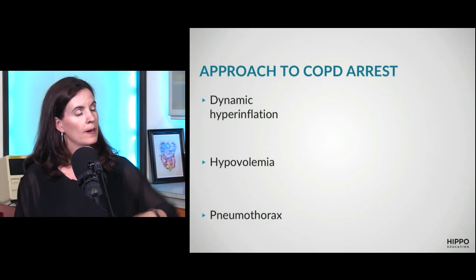Sarah, on the last slide, you put respiratory rate is too fast. Is that because it's going so fast that they don't have, again, that chance for full expiration? Exactly. Okay. And what I mean by that is that the setting of the respirator on the ventilator is too fast for them. Because at this stage, they're not breathing on their own, you want to slow that vent respiratory rate down so they have all the time they need to exhale. Okay.